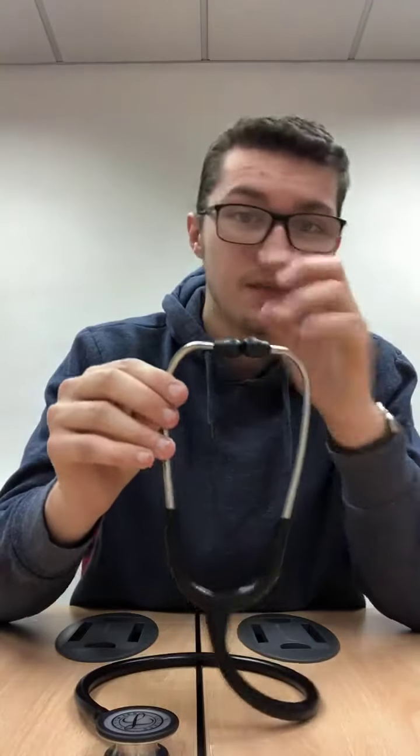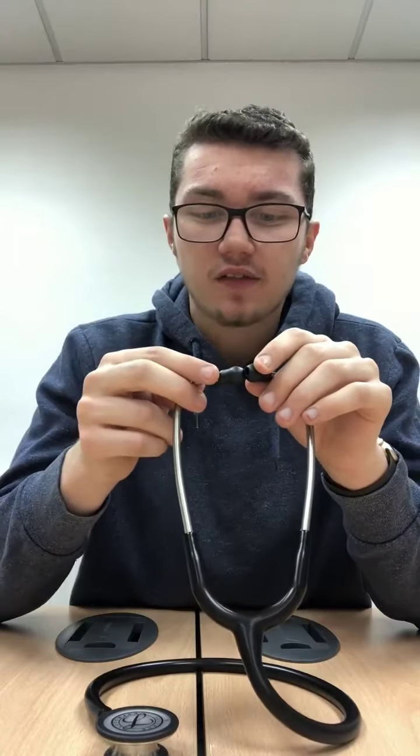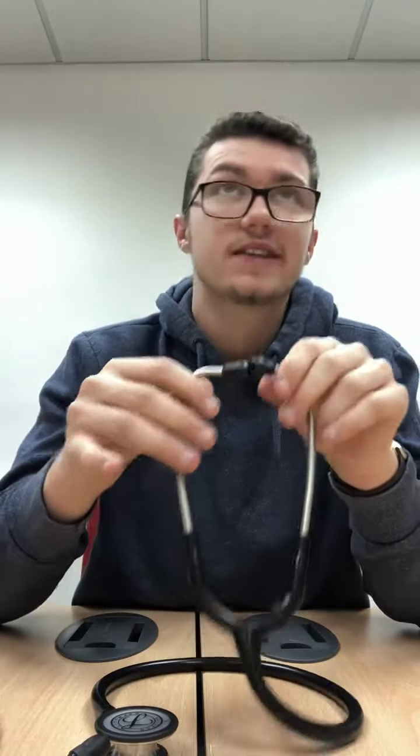I don't find any air escaping on the actual chest piece itself, so that's really good. Now with the ear tips — these ones on the cheaper stethoscope can be quite uncomfortable. The Lippmann ones are very comfortable in your ear; you don't really know they're there. They're nice and soft but they also have enough seal around your ear to stay in. The cheaper ones you can move around and they'll sort of just fall out, but these really do stay in quite nicely.